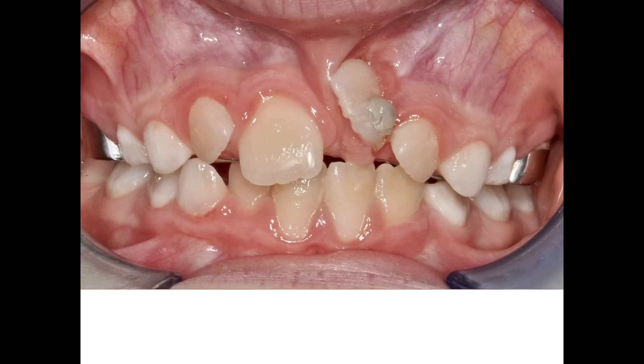After two months of traction, I remove the wire, ready for the next phase. Please note how the position of the button, which was displaced on the distal side of the clinical crown, has worsened the tip of the tooth, which is now rotated. If I'd put the traction point a bit more mesial, this would not have happened.